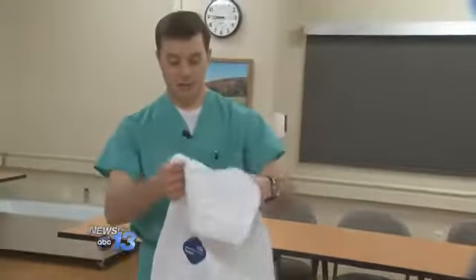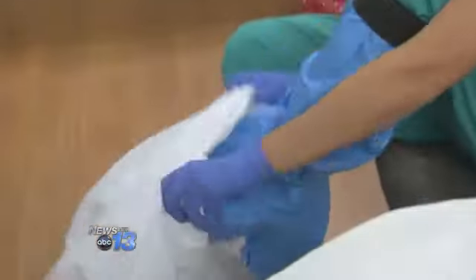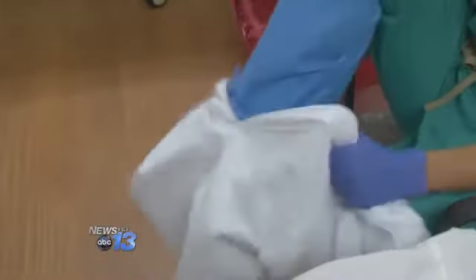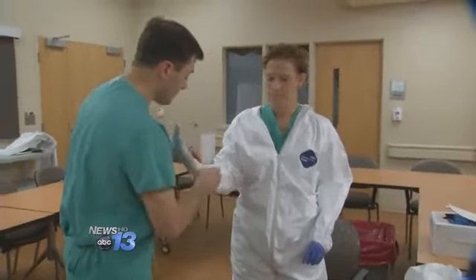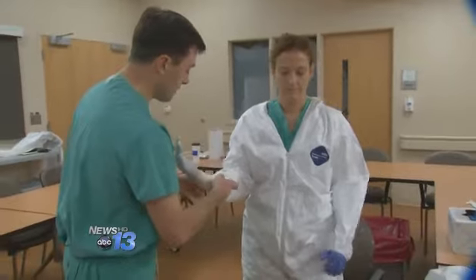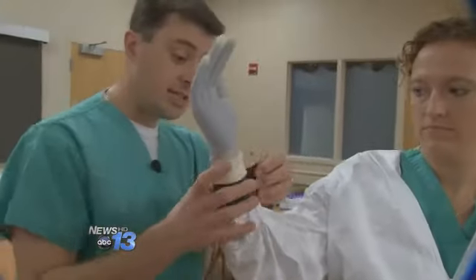The suit protecting against Ebola — the material is a form of Tyvek, so it's fluid impermeable. This is not meant to be a quick process. This level of personal protective equipment is intended to be slow and deliberate, and that's why J.C. is not doing this herself. All the while, there's a third person with a checklist making sure they don't miss a thing.